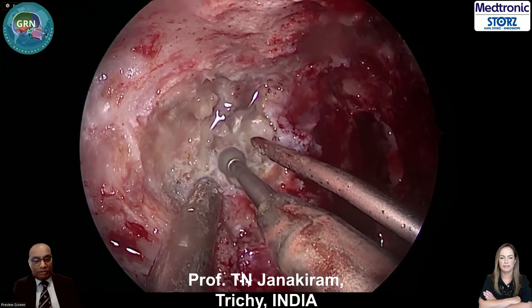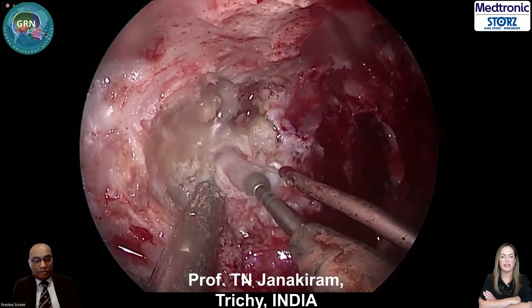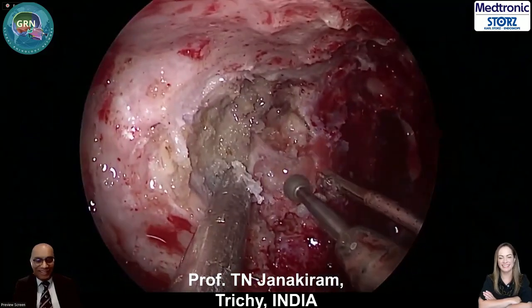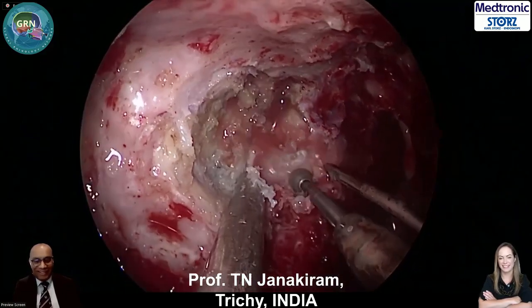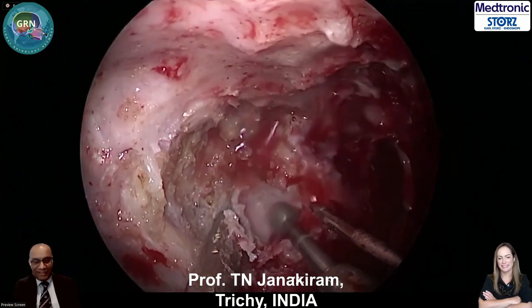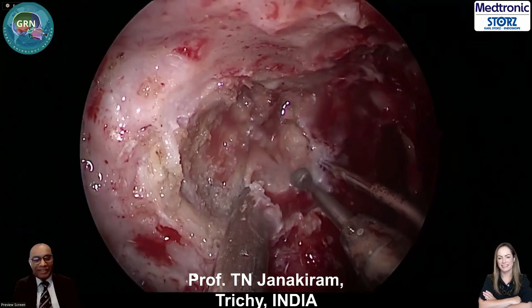I just realised what you meant there, Ashok. Yes. That's the medial pterygoid plate. I'm drilling off the medial pterygoid plate. Correct. Yes. Thank you.